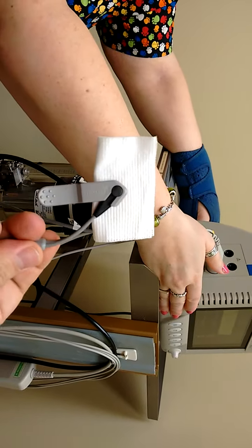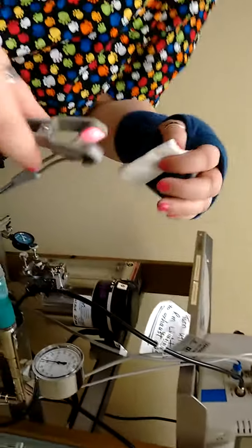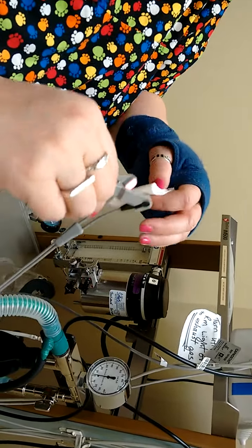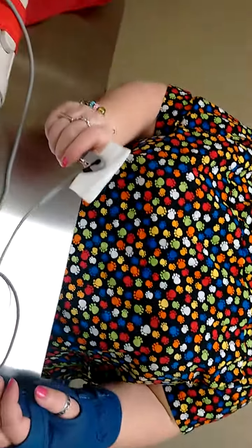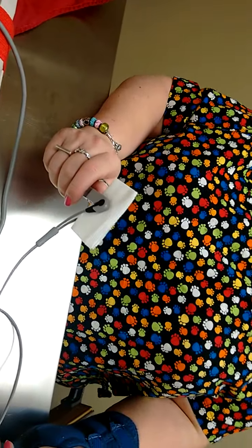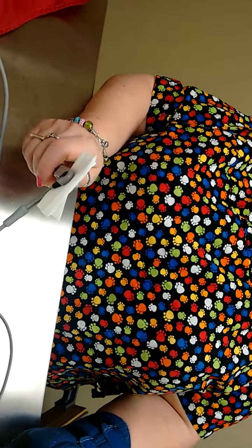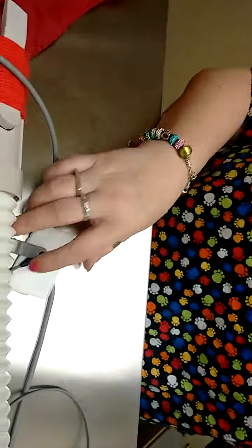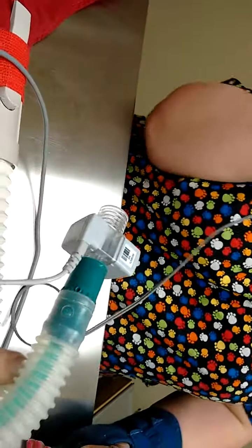This one is for pulse ox. It's like when you go to the doctor and they put it on your finger. In animals, you hook it on the tongue, and it measures the oxygen and pulse. It can also go on the ear, or between the toes, the webbing between the toes. And remember to keep this wet all the time. I always have a syringe and put a little bit of water, because if the tongue dries out, it doesn't read as well.